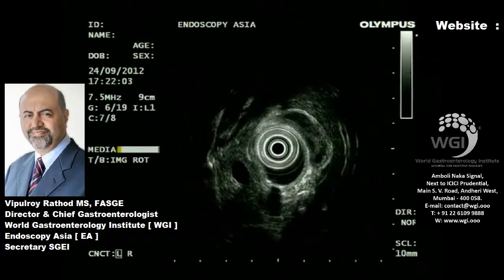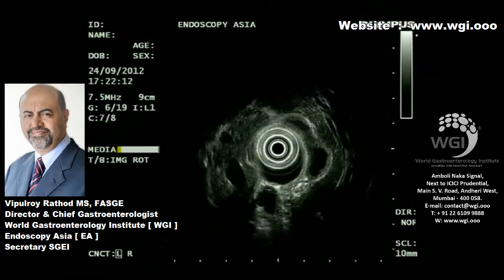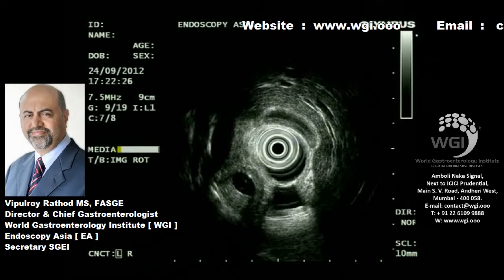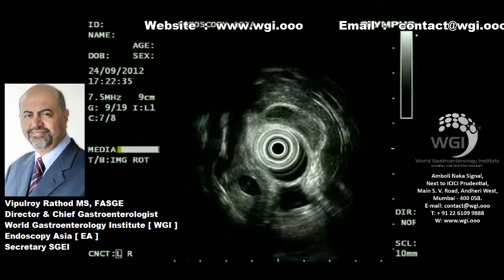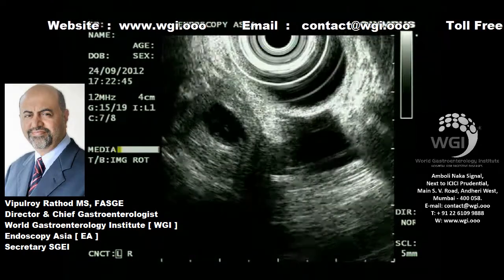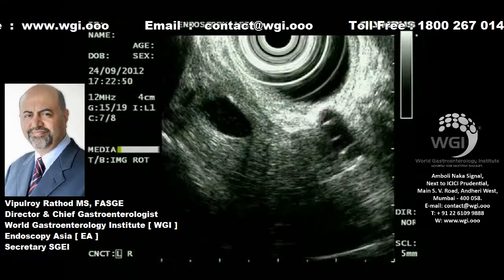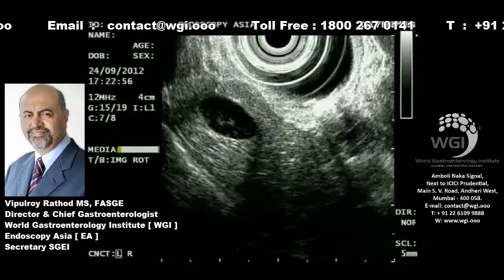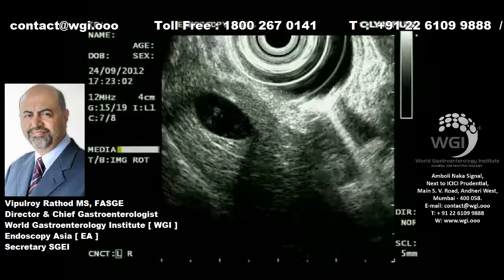A 7-year-old child was referred to us with suspected pancreatitis, diagnosed pancreatitis, to rule out biliary pancreatitis, with few changes of cholestasis and symptoms of mild cholangitis. So here we are seeing a prepapillary portion of the bile duct with dilatation and small imaging microliths floating within.